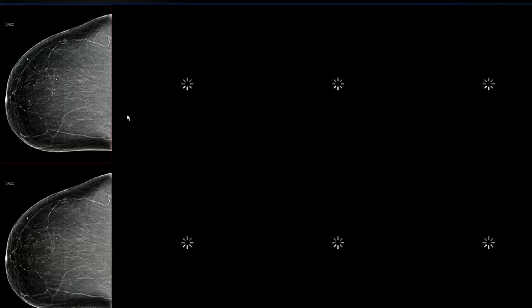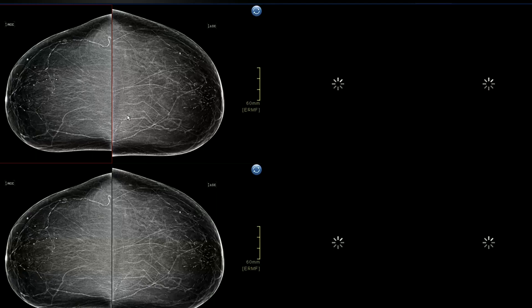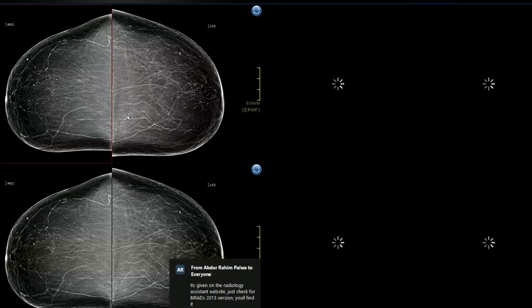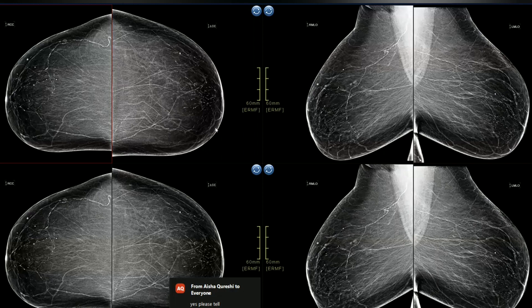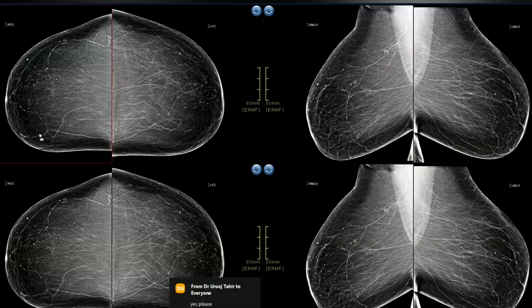Next mammogram: the other case shows benign secretory calcifications — no tram-track pattern. These are benign microcalcifications. Regarding breast density in this patient: this is ACR type B — not A, not C. Always categorize breast density using ACR classification.